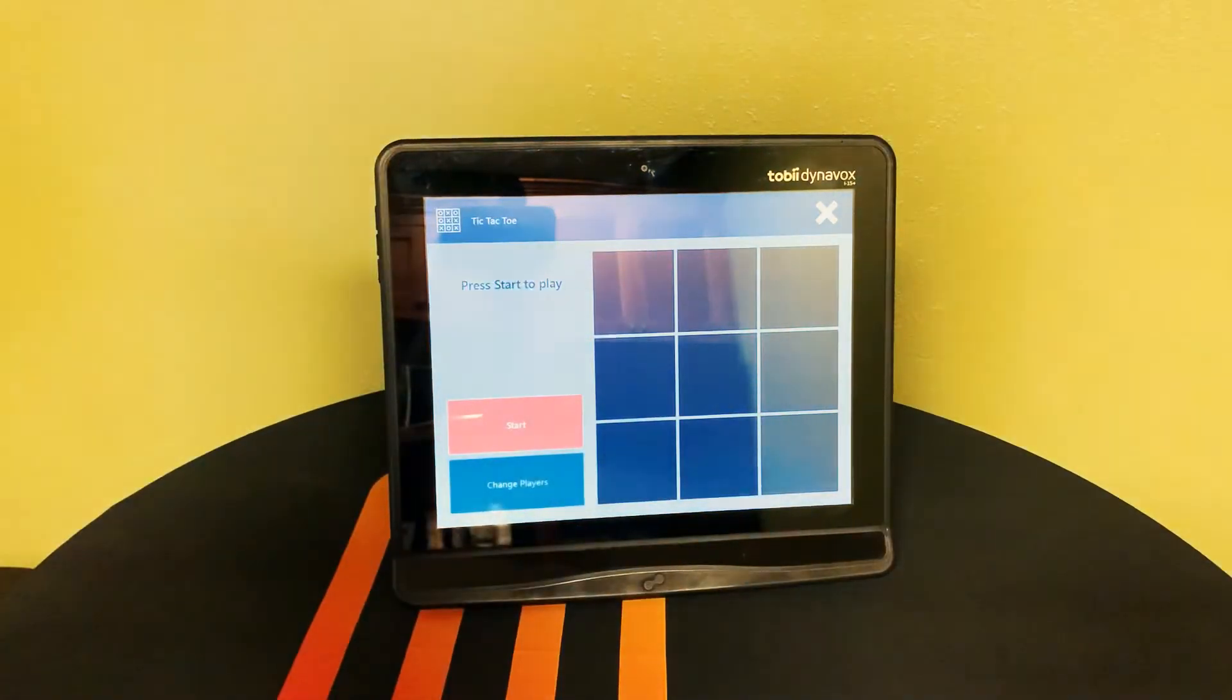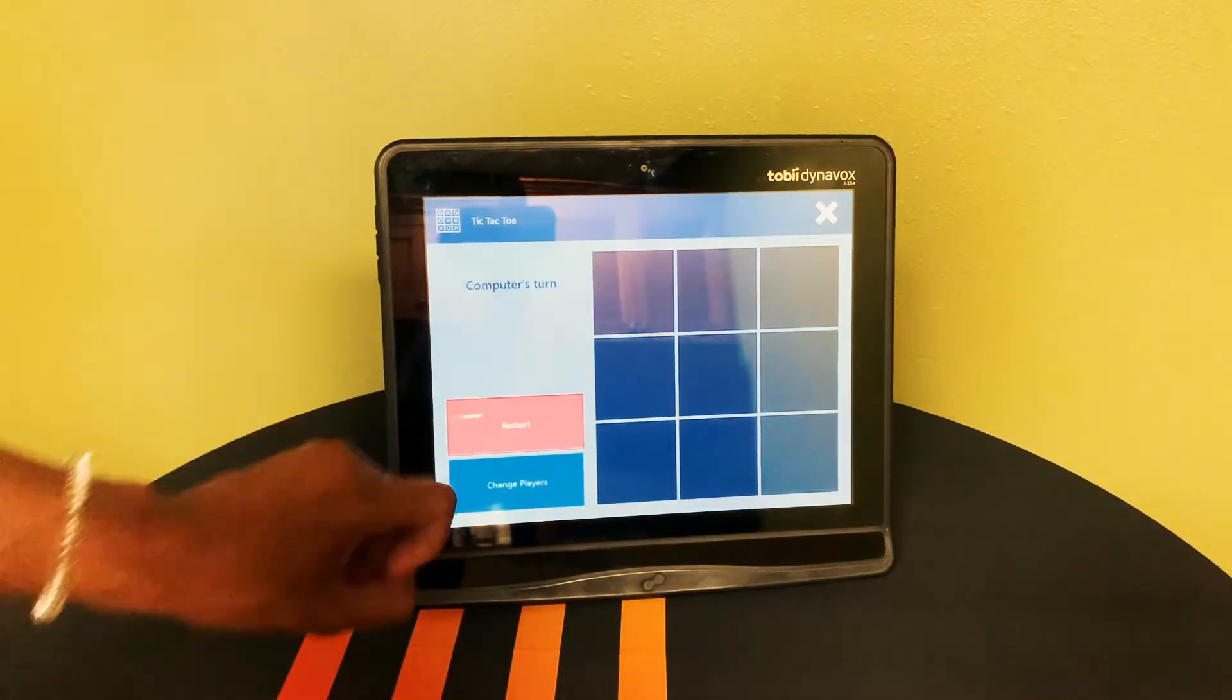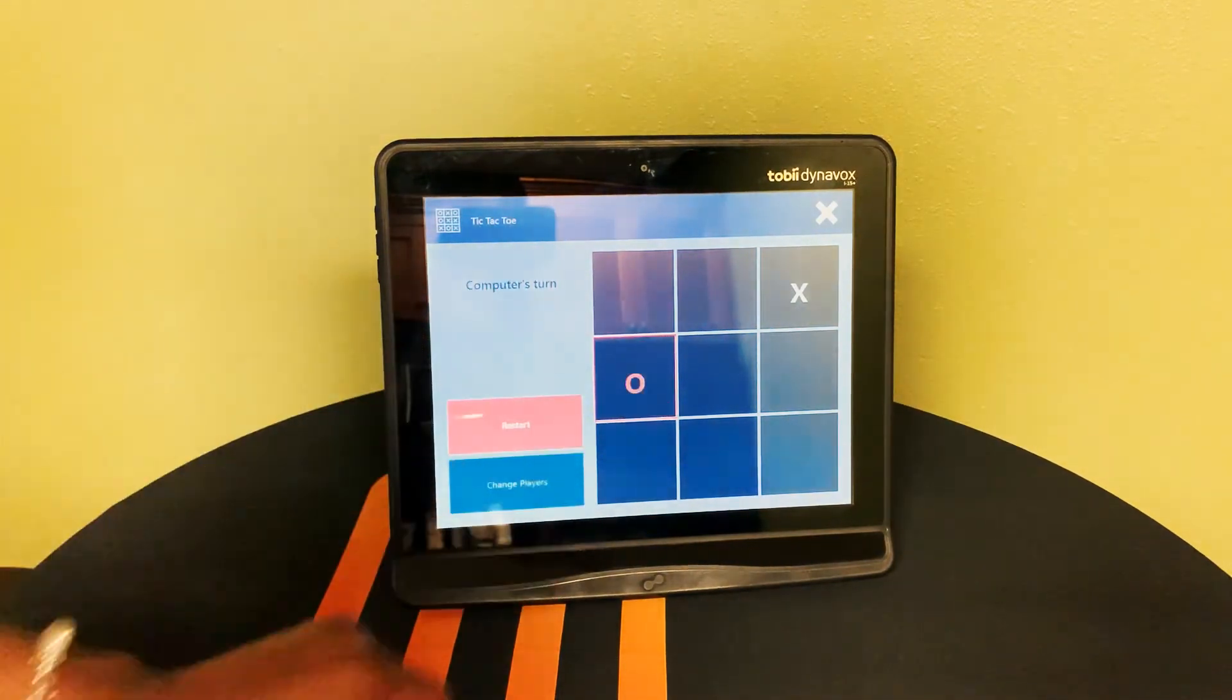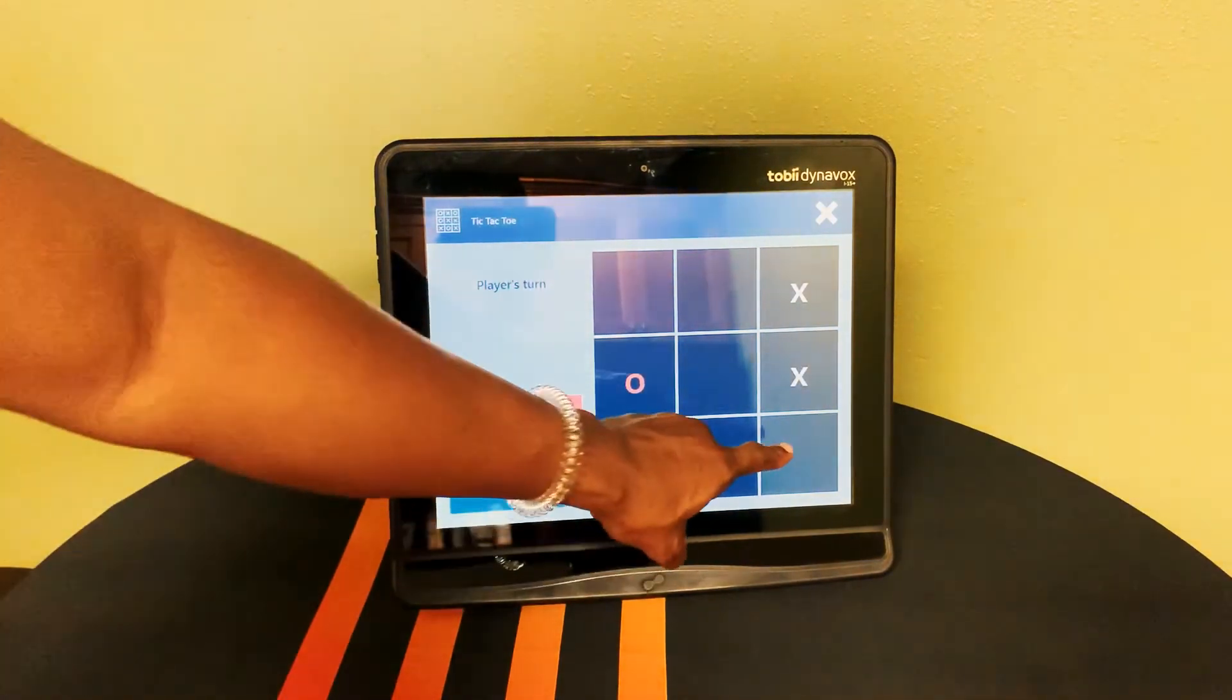Educational and recreational software is also included with every Tobii device such as Find the Difference and Tic-Tac-Toe among many others.